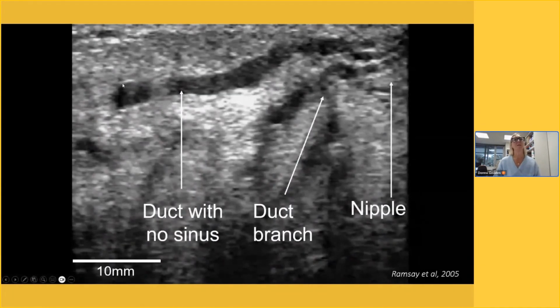So you can see that this milk duct, which is darker in nature, so the black tubular areas are the milk ducts, and the bright areas are the glandular tissue. So we can see this milk duct disobeyed the textbooks and remained a consistent diameter all the way to the nipple where it narrows, and we can see the milk ducts in the nipple here. These two ducts were even more belligerent and just joined just in time to exit into a tiny little duct that then moves into the nipple here.